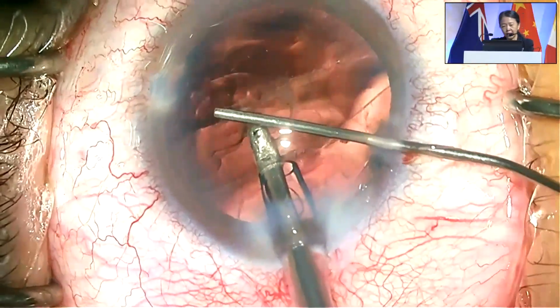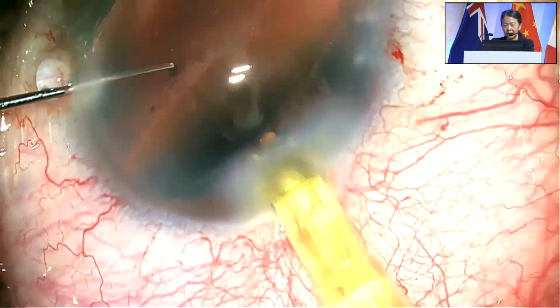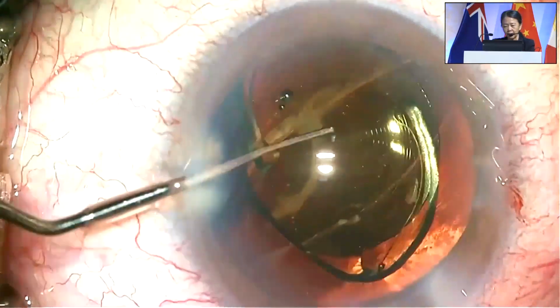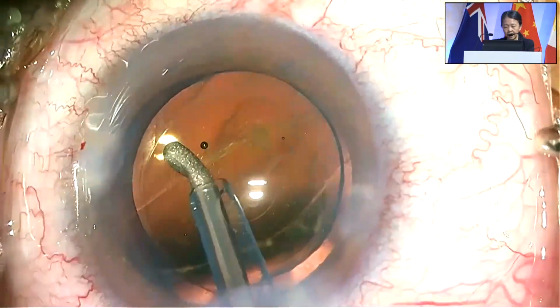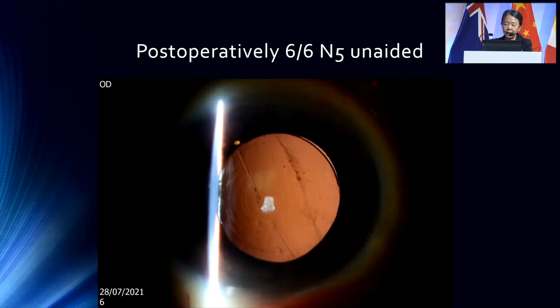So I thought, okay, I'll try and grant you your wish. This is your dominant eye. You want this in. I would have preferred this to be the non-dominant eye. But because there's no loss of capsule, the support is still there, I can do it very simply. And so he had a good outcome for this eye.